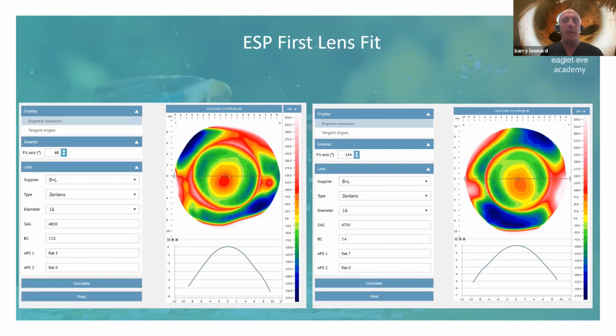And I had the intern do both, because I was trying to teach him a lesson. The first thing he said, by looking at topography and other stuff, it's a weird looking cornea, but he pulled out more of a prolate shape, which is almost what it says there, about a 7.4 base curve. But the problem is then the lens had a big high minus over refraction.